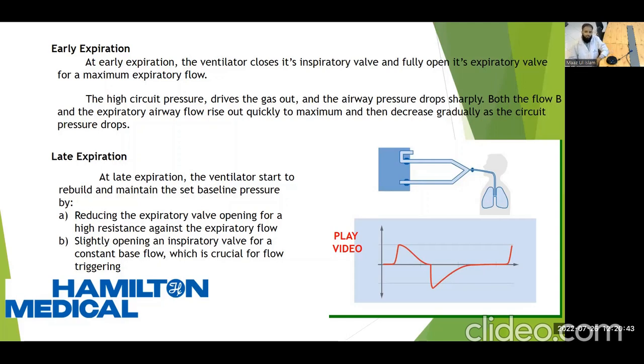Every time we will not set the PEEP of 5 or 3. Sometimes we will set the PEEP of 8, sometimes 10, 12, 15 and so on. So to maintain the baseline, or to maintain the PEEP, this is the phenomenon we have to understand.